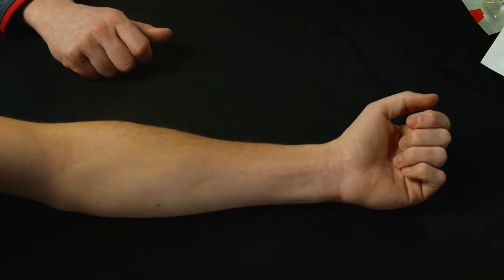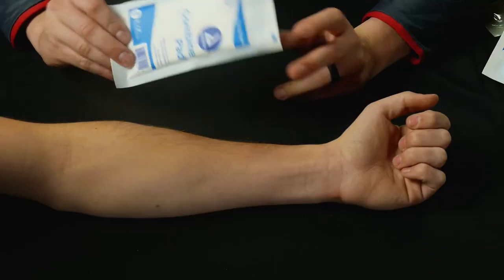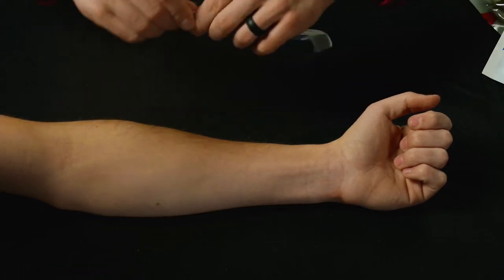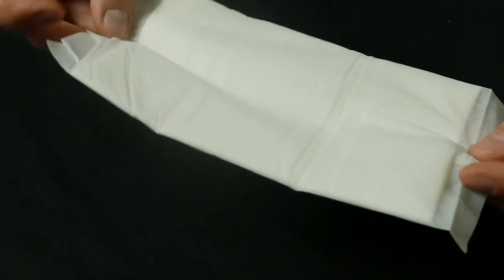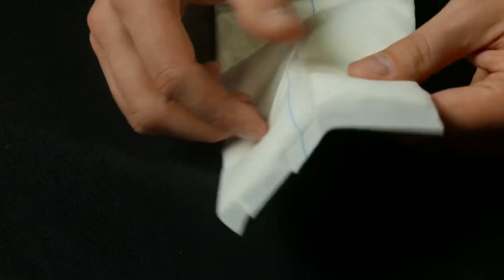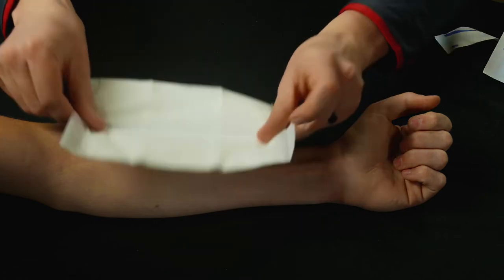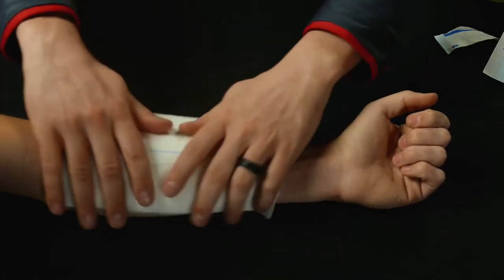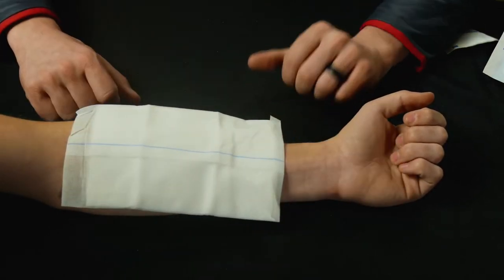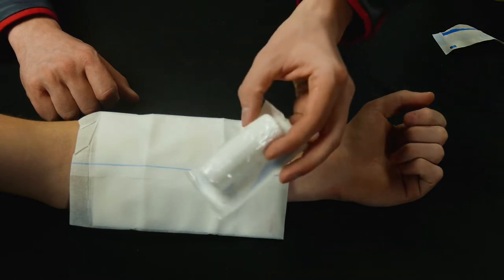If you have a larger area or a lot more bleeding than 4x4s can handle, you can use what are called combine pads. There are also larger ones called ABD pads, or abdominal pads, for abdominal trauma. Combine pads are much thicker than those loosely woven 4x4s — there's an envelope with a thick pad in the middle. They absorb a lot more blood and cover a larger surface area, so you'd place this on the wound and use a roll of gauze to secure it in place.